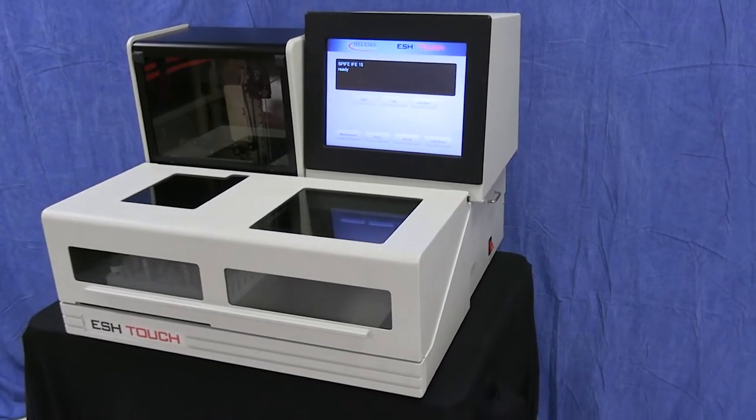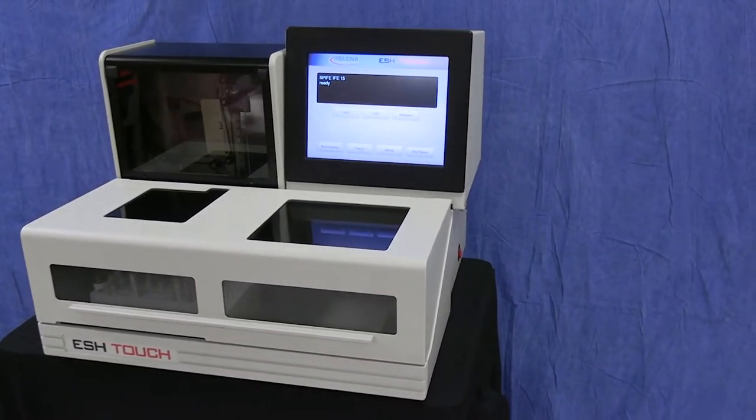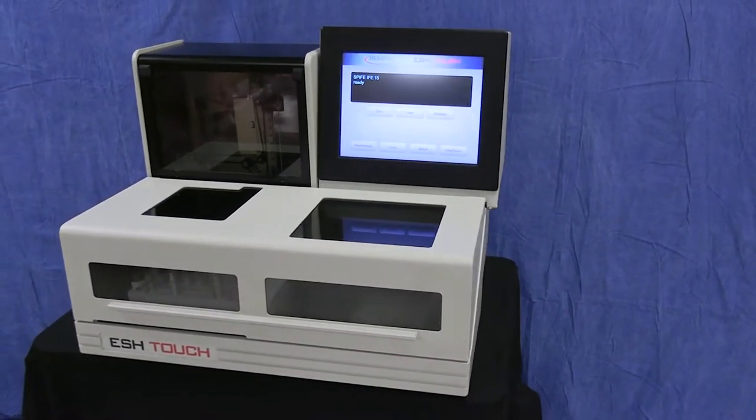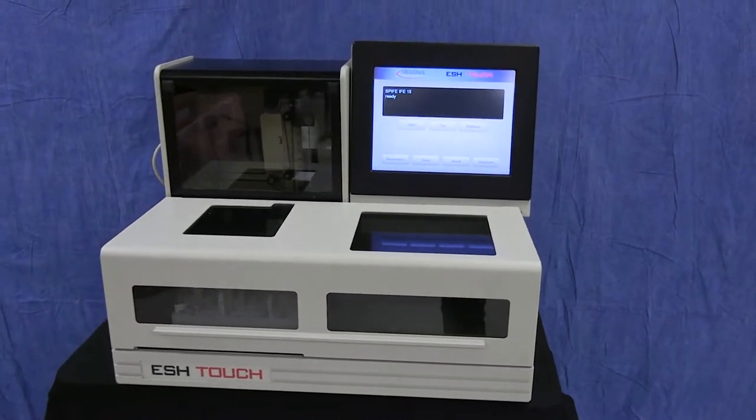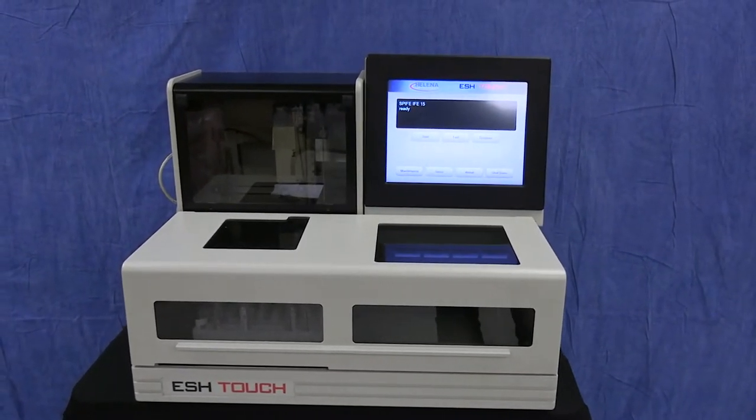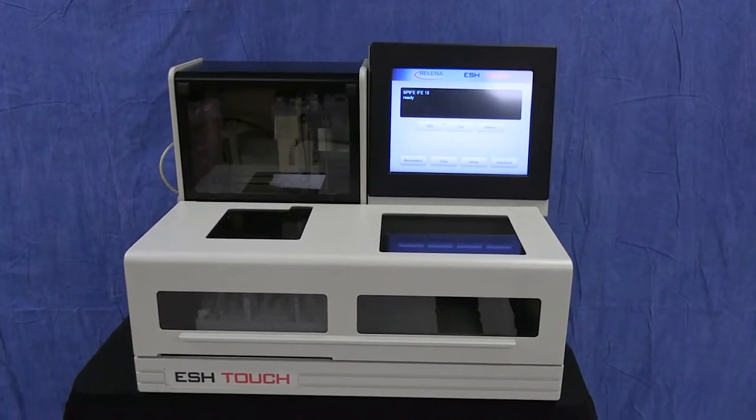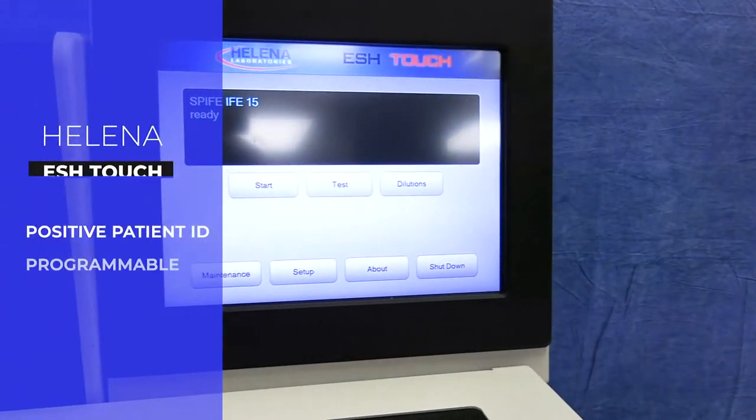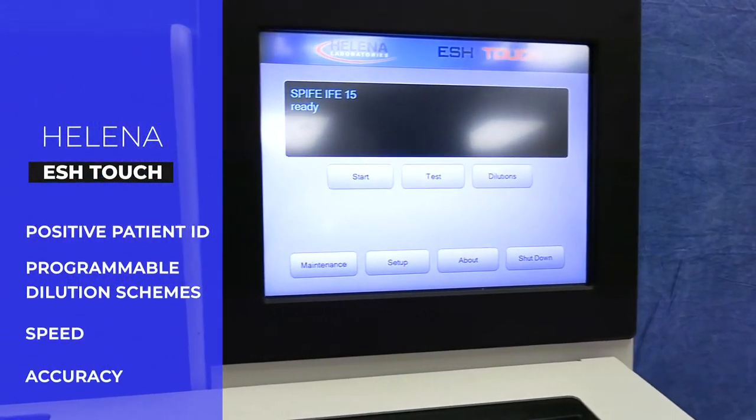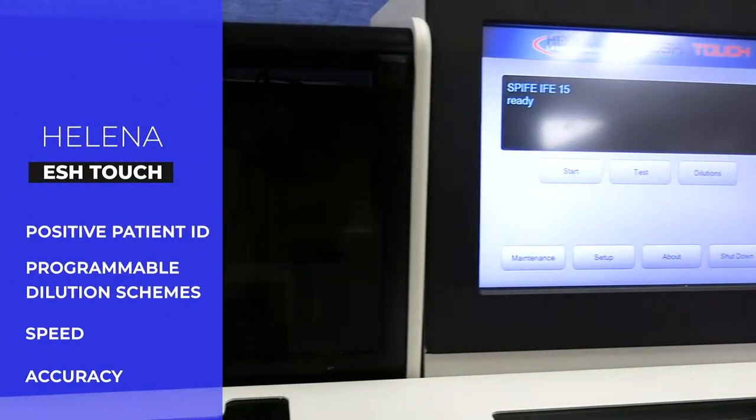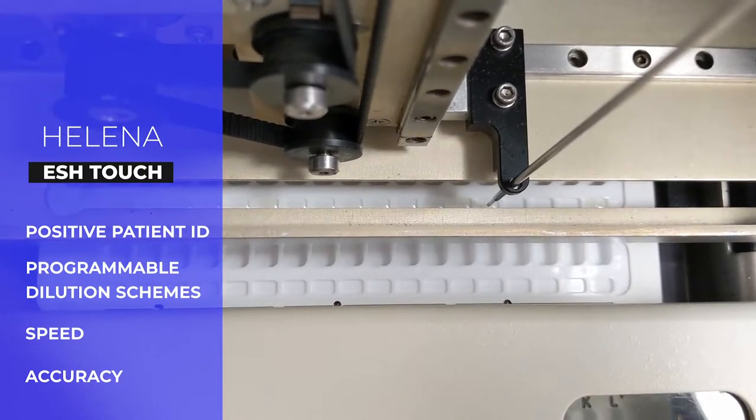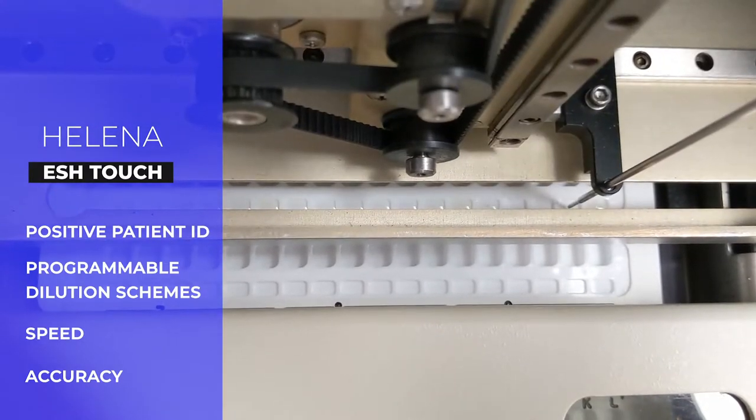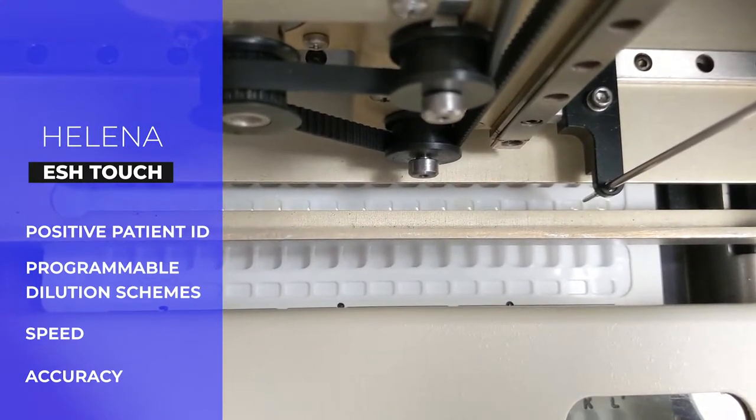Helena's electrophoresis sample handler, the ESH Touch, is a valuable addition to the Touch series, providing automated sample preparation for testing on the Spiffy Touch. Positive patient ID, programmable dilutions, speed, and accuracy are the key features of the ESH Touch.